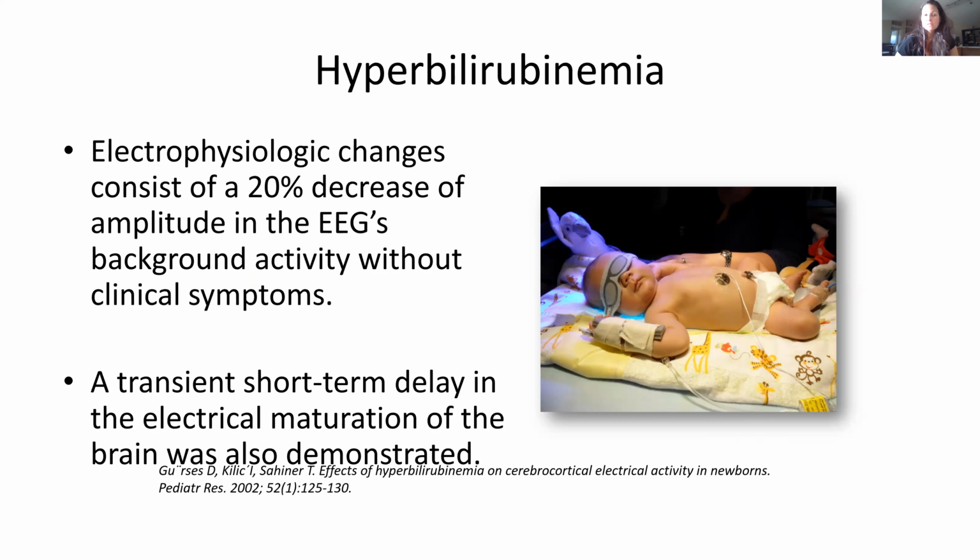And so there are several different papers out there that are looking at hyperbilirubinemia. I hadn't used it in the past as kind of a general baseline. I'd used it in the past when babies with hyperbilirubinemia would come in with funny movements, either just funny posturing, and I couldn't tell if it was just related to the hyperbilirubinemia or did they have something else going on, right? Infectious or meningitic.